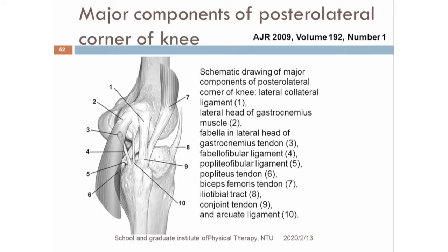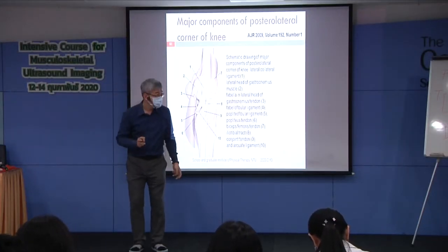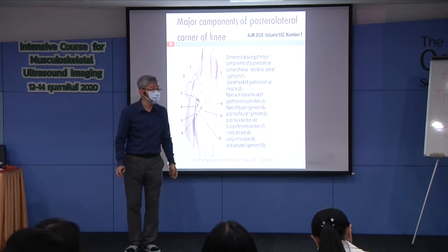Okay, cool. So we finished the anterior part, and we will carry out the medial part first this afternoon after lunch. Any questions? Actually, there are two ways to measure the medial meniscus and the medial collateral ligament, right?